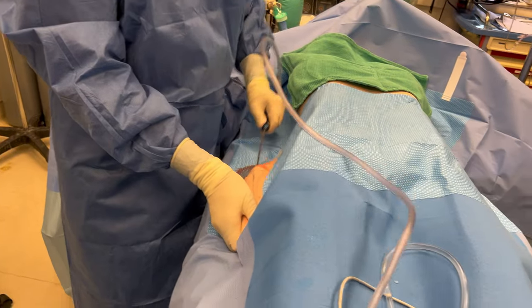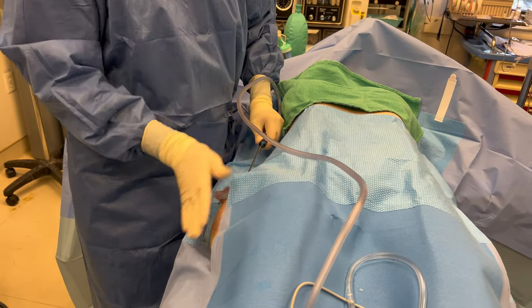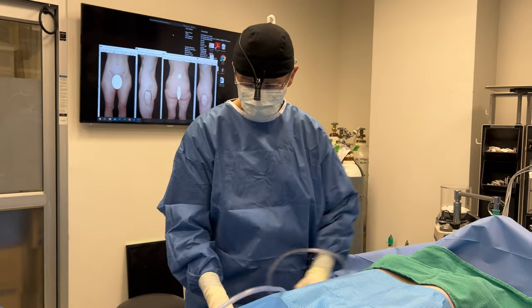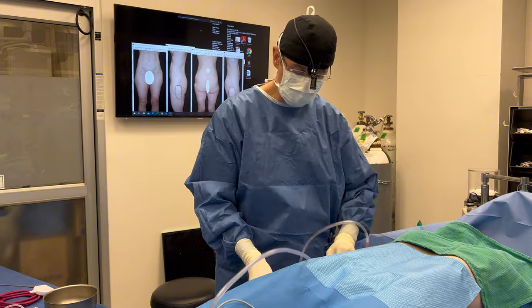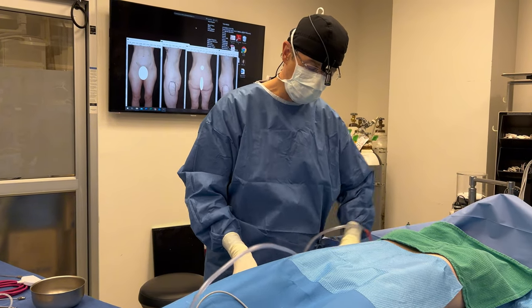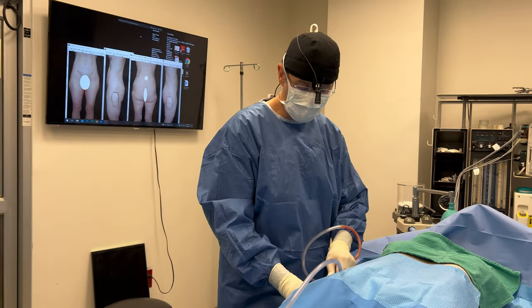I'm going to carefully, gently take out just a small bit. You can kind of see a little bulge here — it's a little bigger than normal because I've infiltrated tumescent solution. My goal is to remove a little bit of fat, not a lot, and then use the Renuvion J-plasma to tighten up the area so it sticks a little better to the deeper muscles.